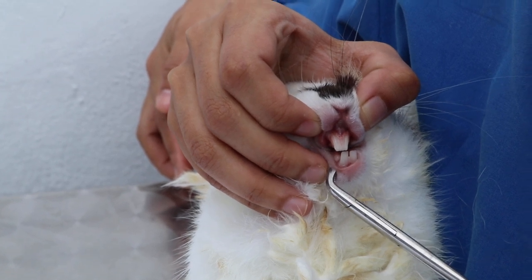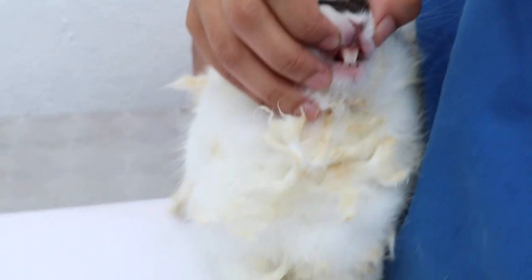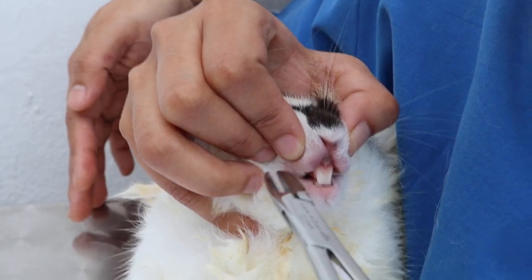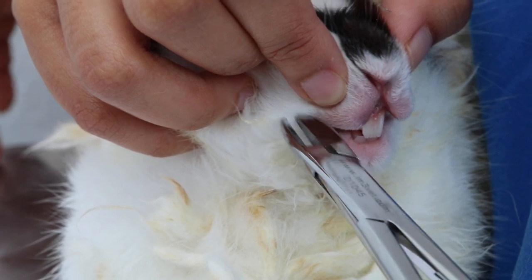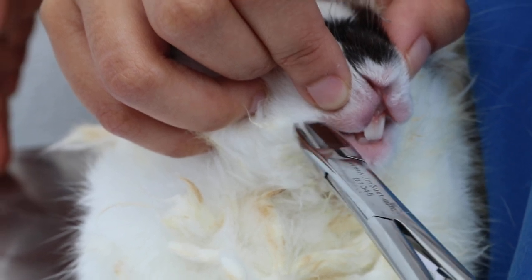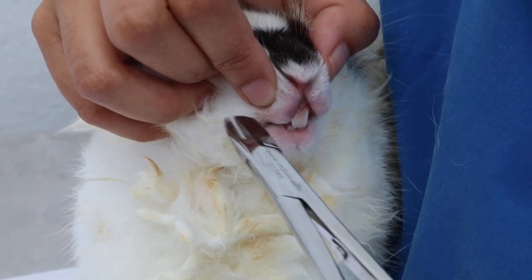The last one is the molar cutter. We cannot fully demonstrate it, but it is used to cut the sharp ends of the molars — the spurs. This is done under sedation so that the rabbit can grind the upper and lower cheek teeth easily and smoothly, because the spurs can cut into the tongue or the sides of the cheeks, preventing the rabbit from chewing.